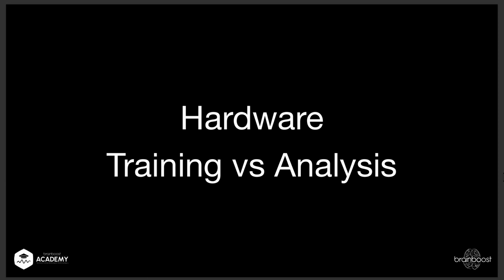Very short, hardware. Of course, most people only have one hardware or maybe a second device lying around. And some people, like we in our center, have 2 different hardware types, one that we use for training and some we use for analysis. What is the difference? Well, in training, in many cases, you only need 1 or 2 or maybe up to 4 channels. But for analysis, of course, if you have a device that has 19 or more channels, then you have a lot of channels and possibilities.